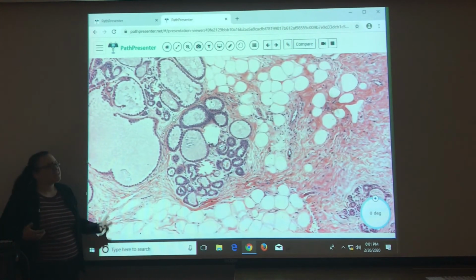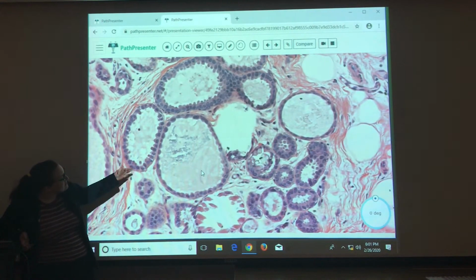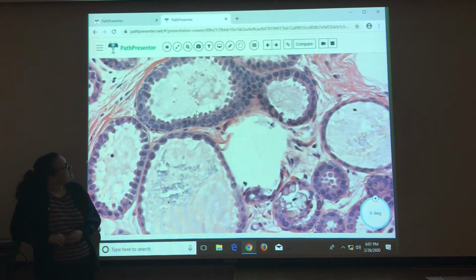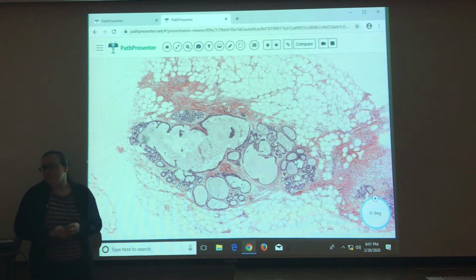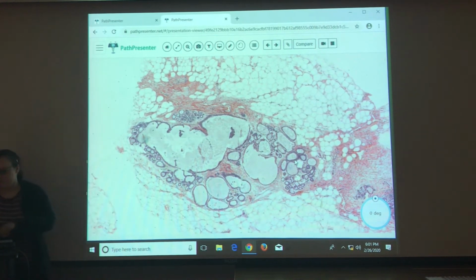The epithelium is a little more revved up, a little more hobnailed, I guess. But if they get really big, they can be attenuated too. The mucus is not really projecting on this. It's more of a flocculent eosinophilic material. But with this general picture, this is not a microcyst, so you want to think mucoceles, okay?